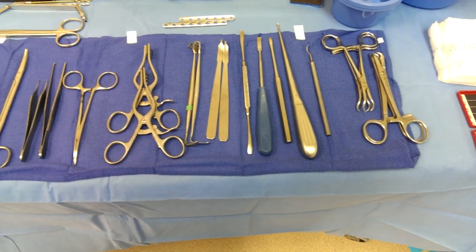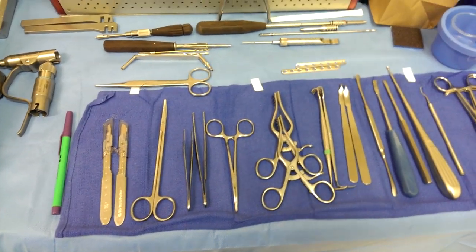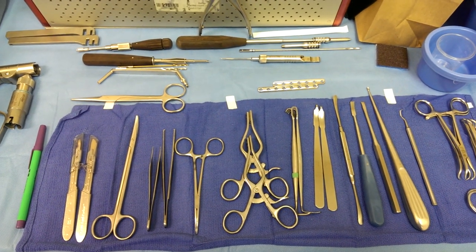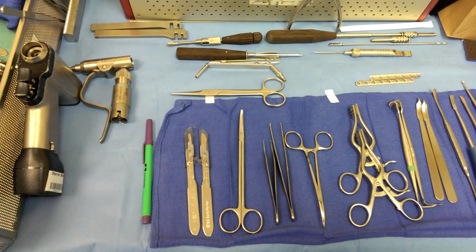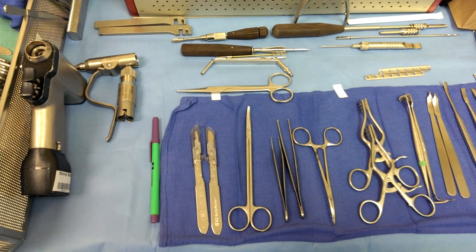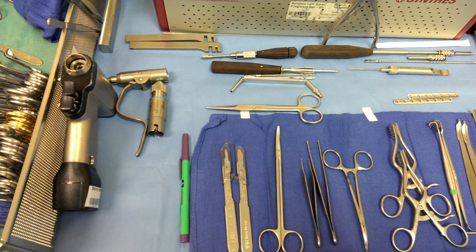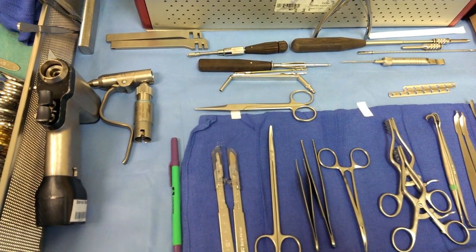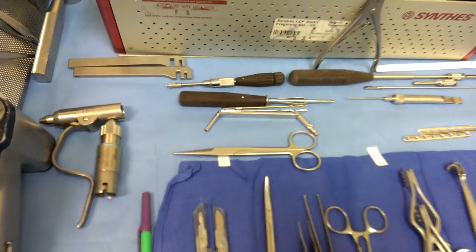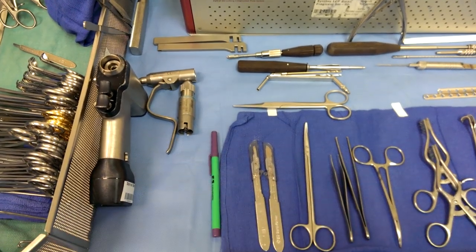That's basically what you'll need to set that fracture into place. I usually anticipate by pulling out locking screws, the drill guides for the locking screw, the drill, the drill bit for the locking screws, and then I'll get my standard screw sets ready — which is the guide, drill guide, and the 2.5 drill and the screwdriver. I usually pull out the 3.5 in case we do a lag screw. And I have the countersink ready also, as you can see right there.